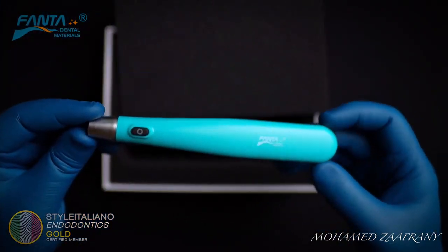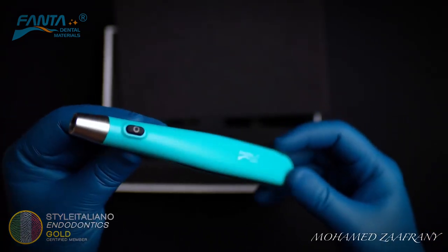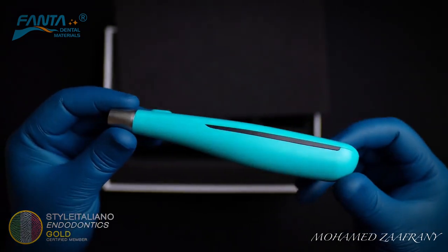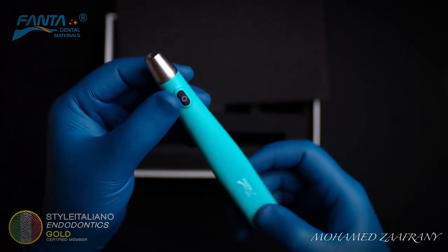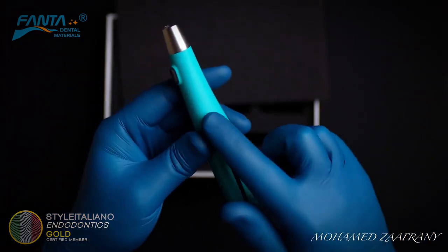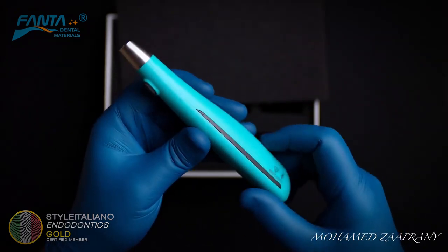This is the main unit of the device. It has a lightweight design and perfect grip. The use of the device is very simple — it has two buttons: one for switching on and off, and the other one for controlling the power.